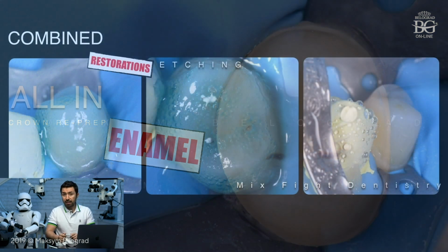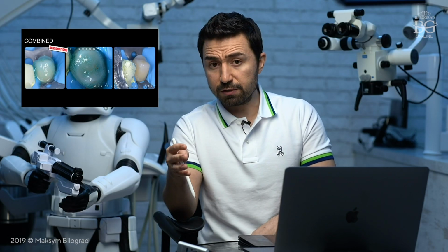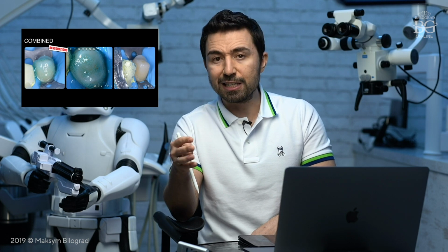And considering the fact that we will be using a metal-free ceramic restoration, which is an Emax crown, and we will bond the Emax crown to enamel with a good surface fit, this crown can be thin. It is against the rules. What I would like to mention is that it is against the rules written in the instructions by Ivoclar for the Emax material. As far as I know, they say that you have to give at least 1 millimeter.